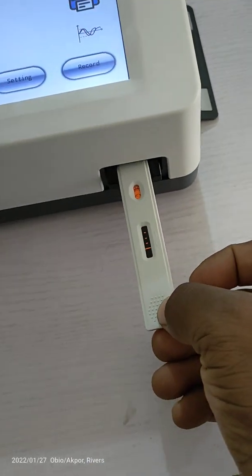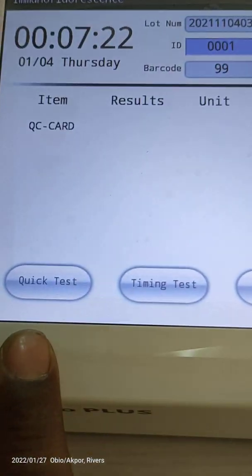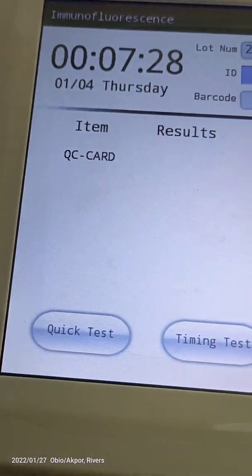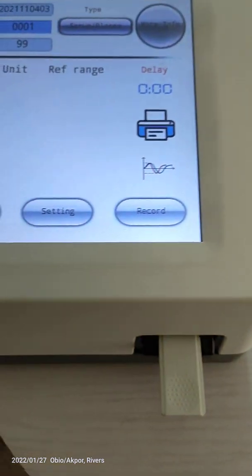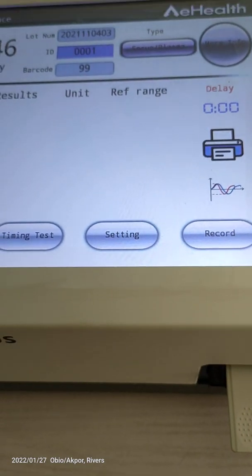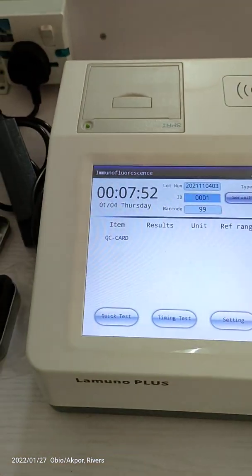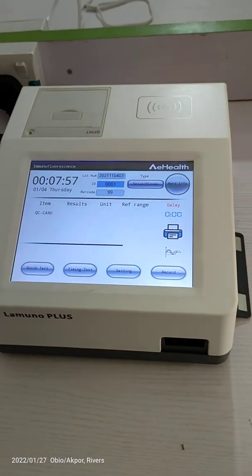You hold the cassette and slot it in. You have two options: quick testing and timing testing. Timing testing is when you want the machine to incubate the cassette inside for however many minutes the test parameter requires, then give you the result after. But we normally prefer quick tests — you incubate all your tests outside, time them yourself, and once it's time, you put it in and read.